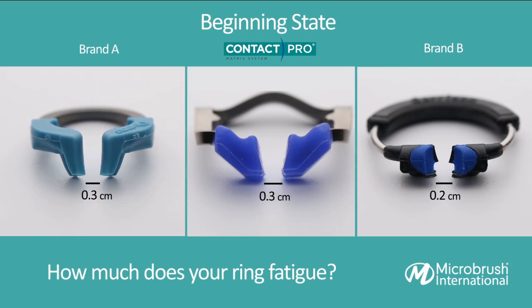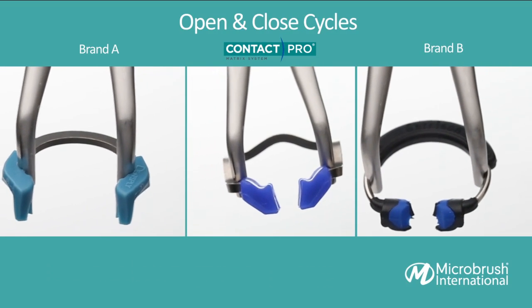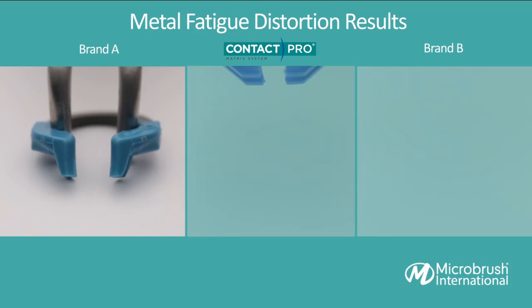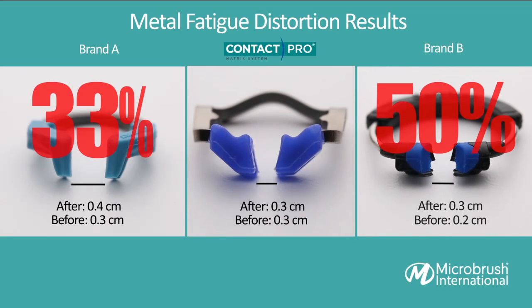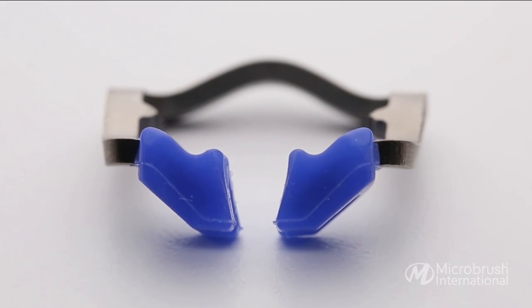And simply what they did is they took a few of the leading brands out there and simply took the plier apparatuses to them and began to stretch and manipulate those over time. Very simply, over a few times, only 5 to 10 compressions and decompressions of that material, and what the overall effect was simply a decrease in strength, or what we would call metal fatigue.